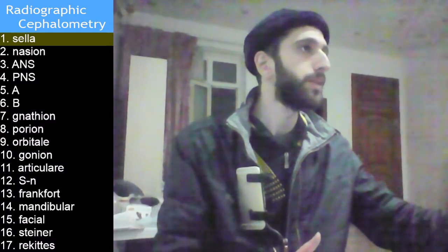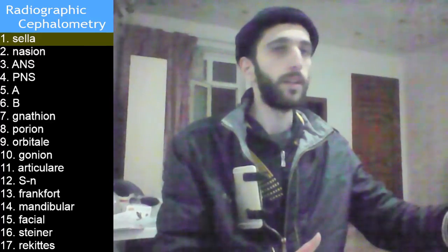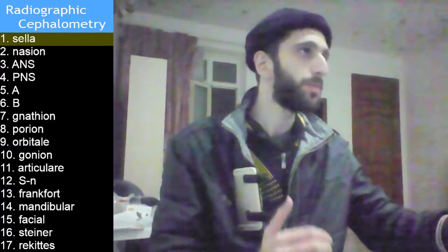So the sella is the center of the sella turcica. It is the midpoint of the horizontal diameter.